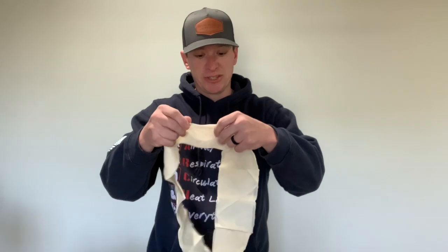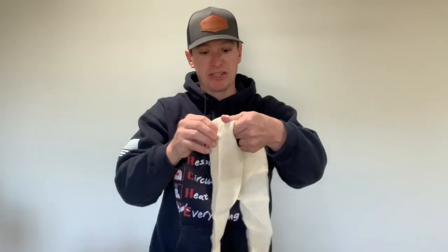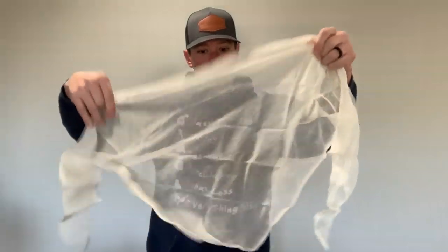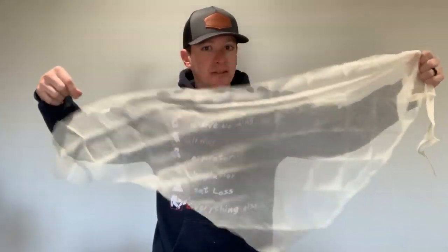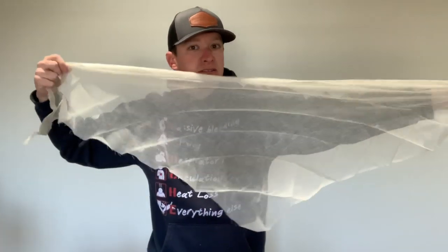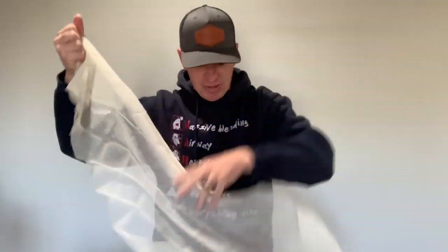So this is a regular triangle bandage from Dynarex — it's on what's in every single ambulance and comes in most first aid kits. It's a cheesecloth kind of material. Works great for what it is: slings, securing splints, things like that.